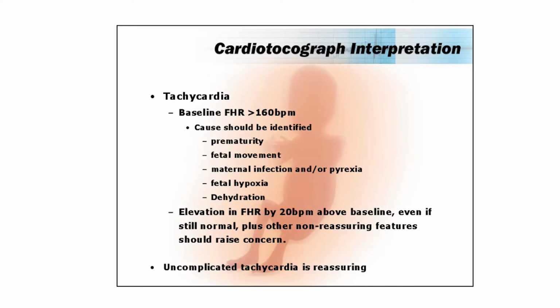The other really interesting thing, which I always make the argument that we probably shouldn't even try to do it, is that the other physiological piece of information we do know to be true is that the chemoreceptor response, not the baroreceptor, the chemoreceptor response in preterm infants is unpredictable.